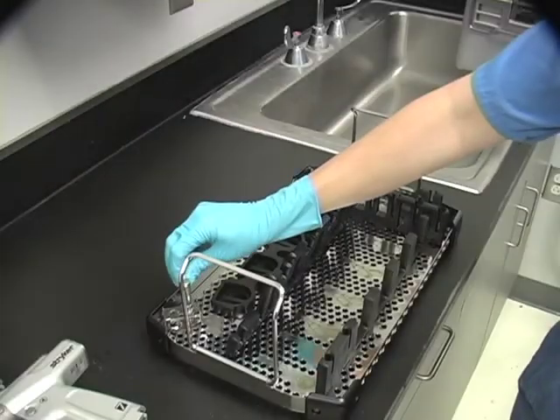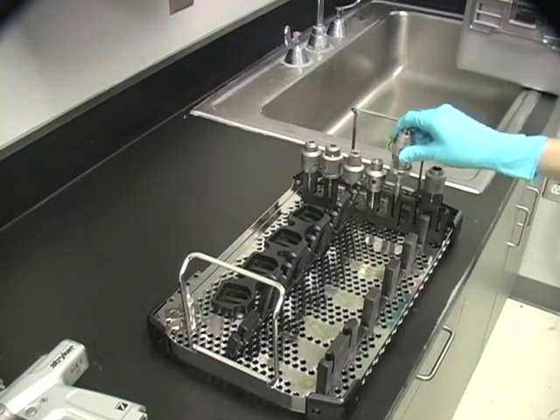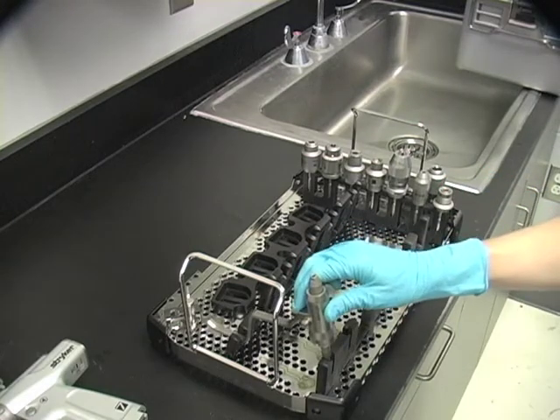The four handpiece sterilization case can hold up to eight attachments, including two chuck keys, two collets, and four handpieces.